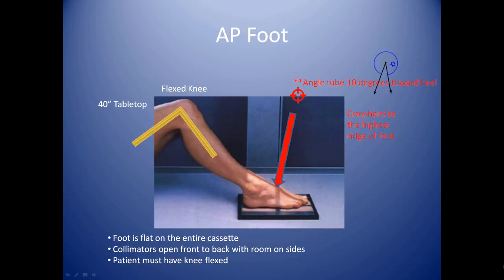For the AP foot exam, you'll have the patient on the table in a sitting position. Some will prefer to lie down, and it is possible, however it can complicate things — the force of their leg may cause their toes to lift up and their heel to push the cassette across the table. So I'd simply recommend getting your patient to sit up, if at all possible, while they flex their knee and place their foot flush onto the cassette.